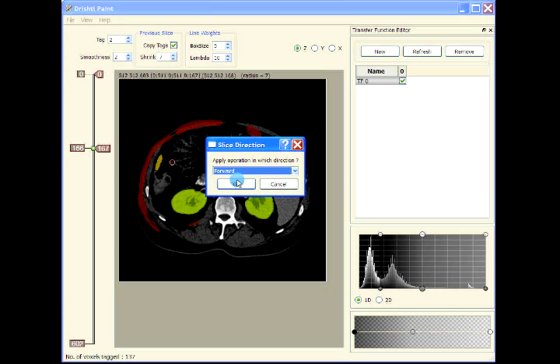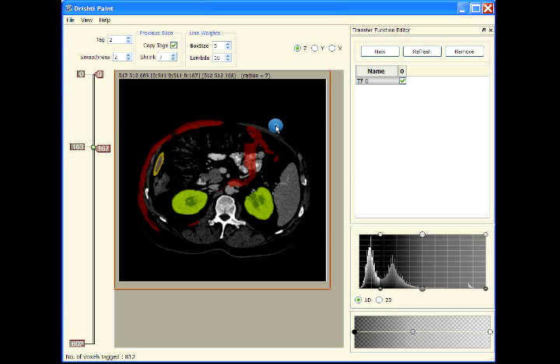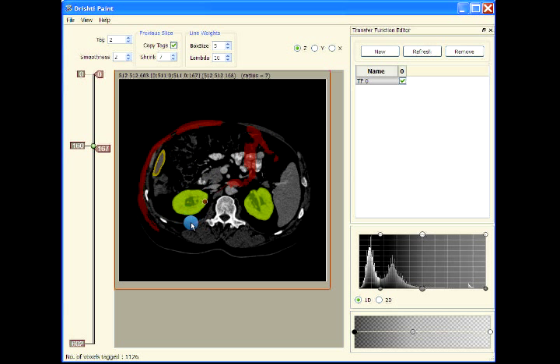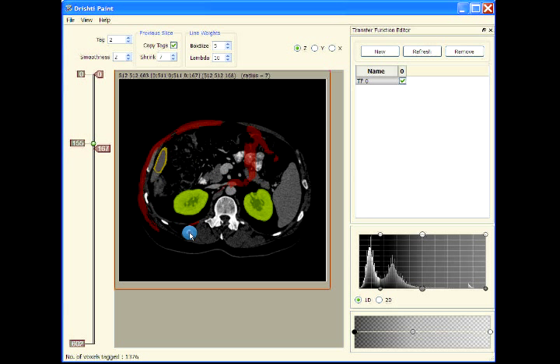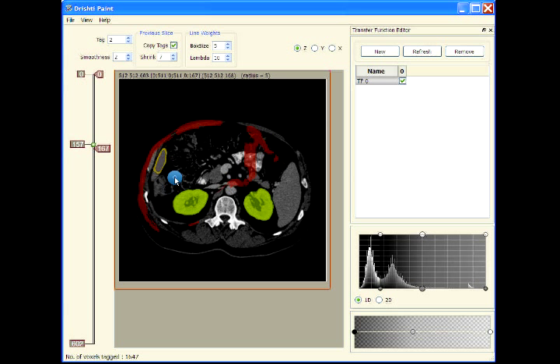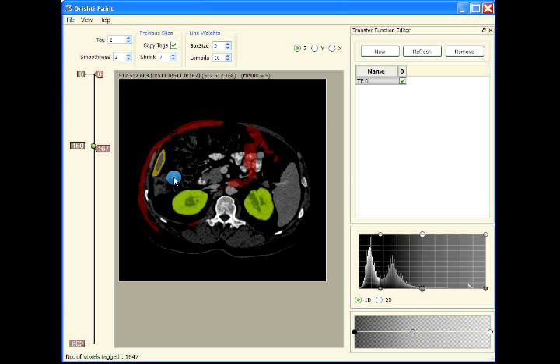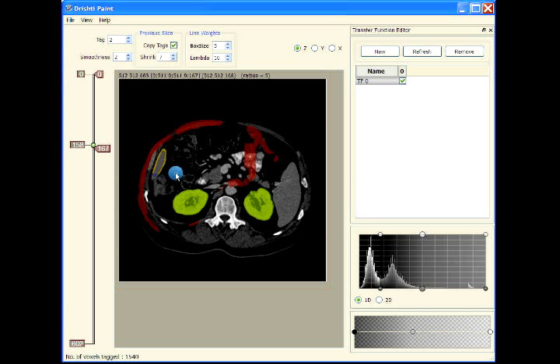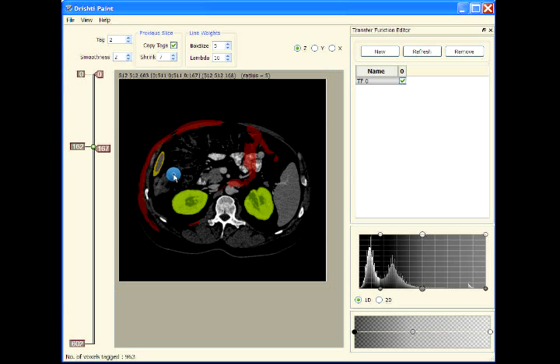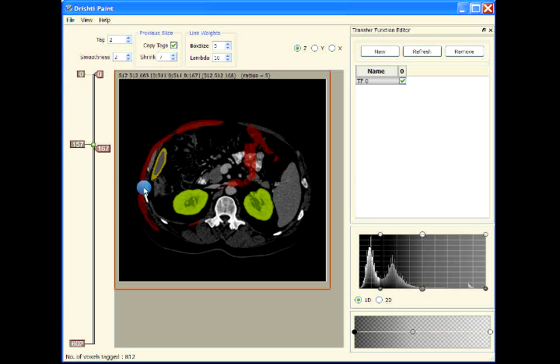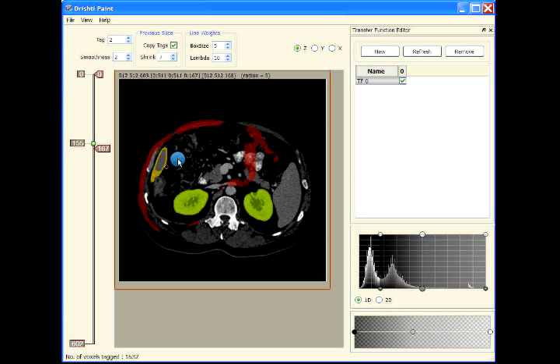Press Shift-T and go backwards. Let's see how it fares. If it's going okay, we'll continue. Otherwise we can stop. Let me add a bit here, tag, and then go forward and update the slices. Go back and update the slices again. Add a tag here.